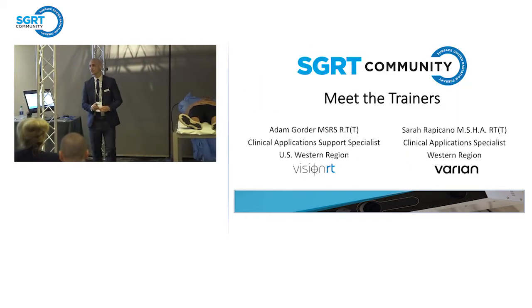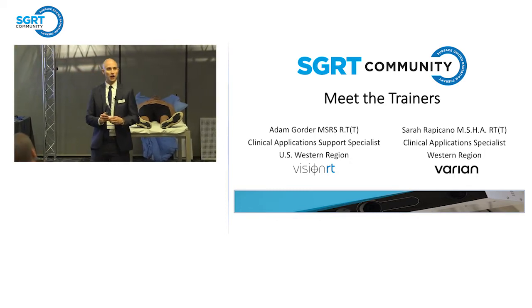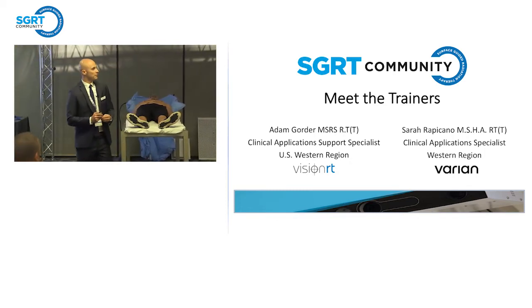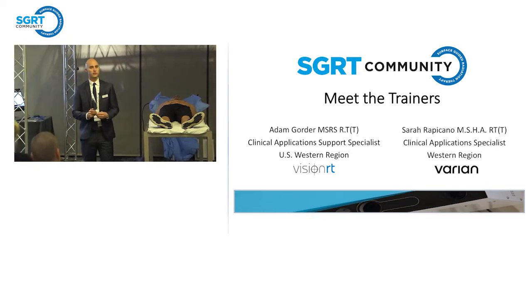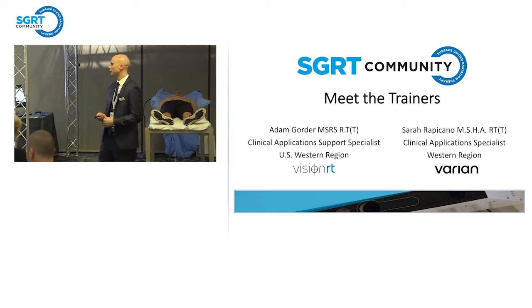I just want to first introduce myself. My name is Adam Gorder. I'm one of the clinical application support specialists with Vision RT. I'm based in the U.S. Western region, and I train the Align RT product. And this is my colleague, Sarah. I'll let her introduce herself.